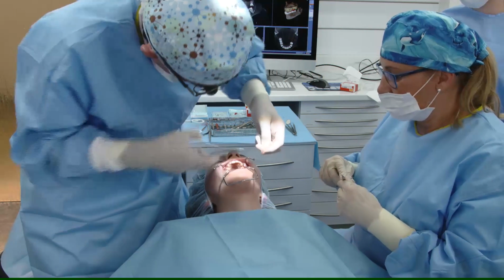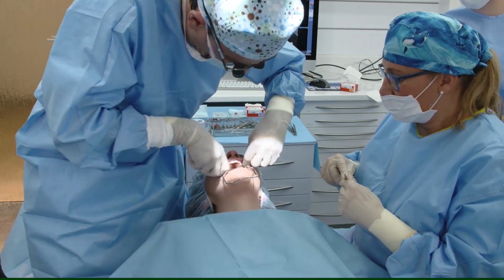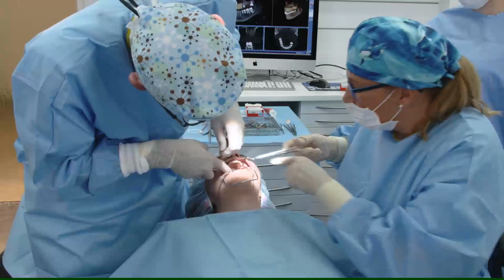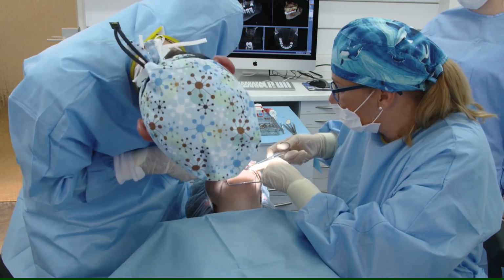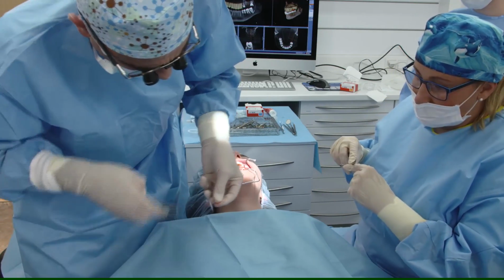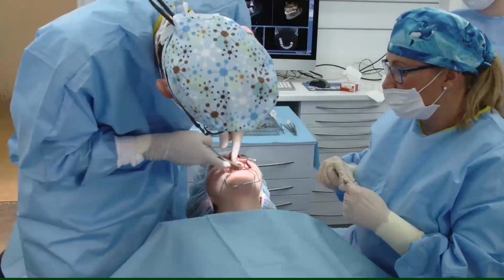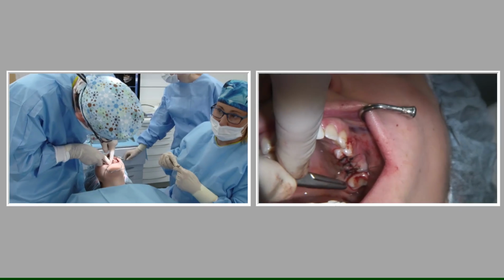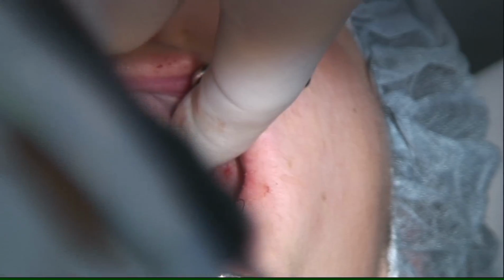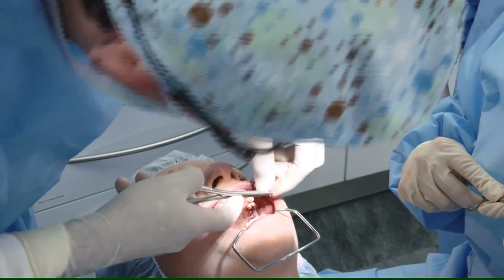Like I said before, the socket preservation was done alio loco in another clinic 4 months ago, and with allogenic bone. And there are studies from SPIN-NATO 2013 that show that the remodeling and the development of new bone may be limited, and a scientific proof that we get a biological incorporation of the allogenic material is still missing.